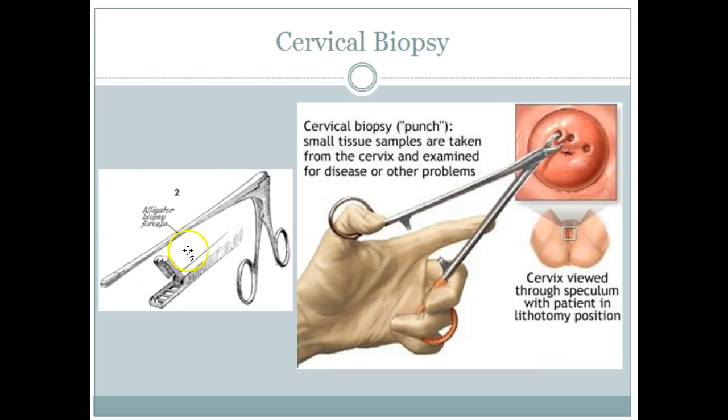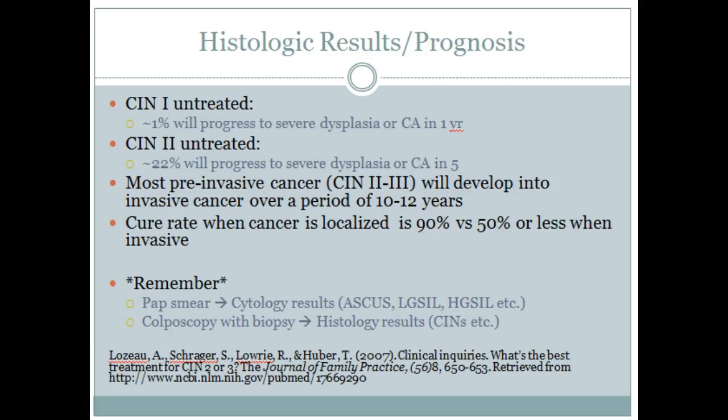So this is the instrument, the biopsy forceps. And then generally speaking, if a biopsy is needed, women might feel a little bit of a pinch or they might not feel it at all. So again, that's nice anticipatory guidance for women. They're just cutting a little pinch out of whatever area looks concerning.